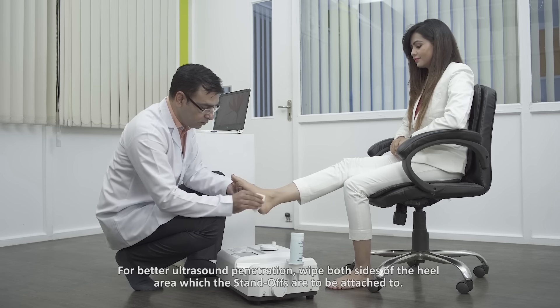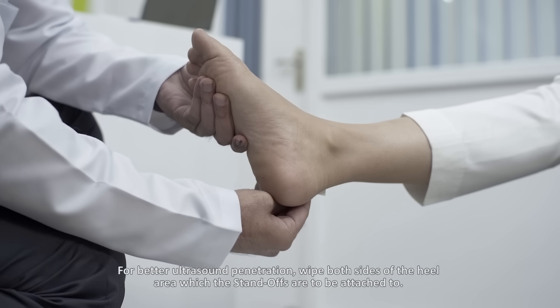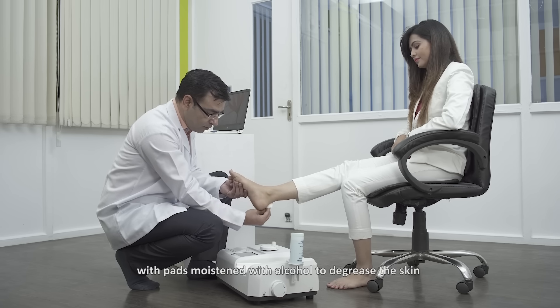For better ultrasound penetration, wipe both sides of the heel area where the standoffs are to be attached, with pads moistened with alcohol to degrease the skin.